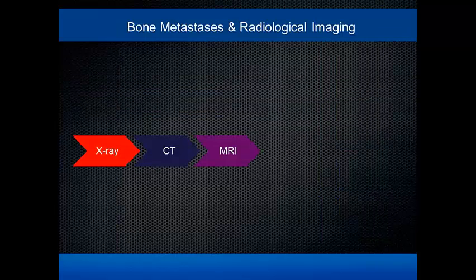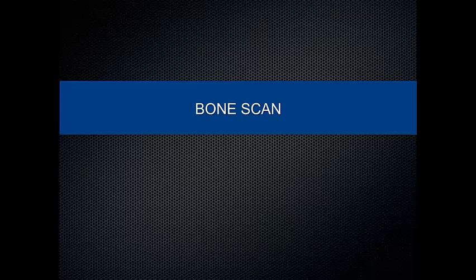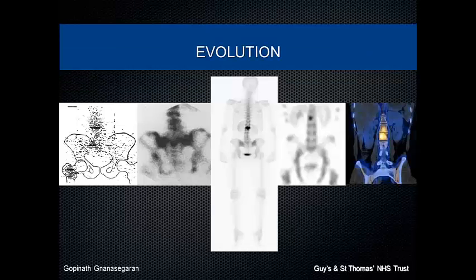So again, radiological imaging, it's the same thing. It helps in detection of the metastasis, pathology, and prognosis. But my job is to convince you there is a role for MDP bone scan. Historically, you started with rectilinear scanners, then you went to planar imaging, then we converted to whole body, then SPECT, and in 2004, 2005, we went to hybrid technology. Before that, people used to do what is called software fusion, by doing a CT in a different machine and a bone scan conventionally, and trying to fuse them. It used to work, but the problem is you need more staffing and the technology is quite cumbersome. Only with the most recent technology, in 2006 and 2007, most of the cameras coming out are hybrid cameras. And in fact, in future, there'll be nothing called a conventional gamma camera. Every camera will be a hybrid system.